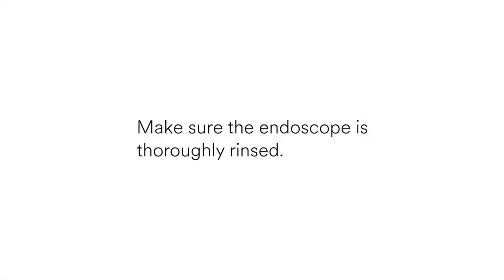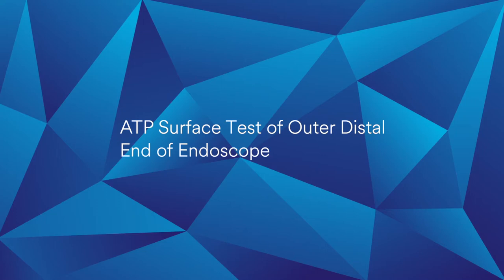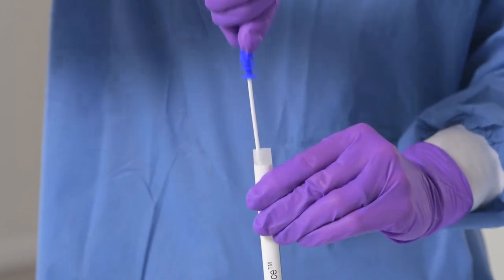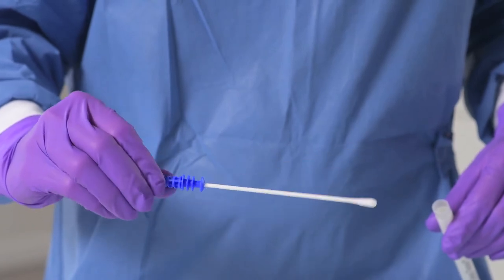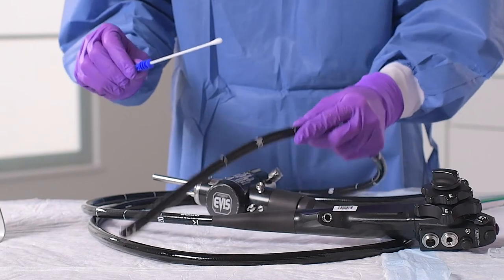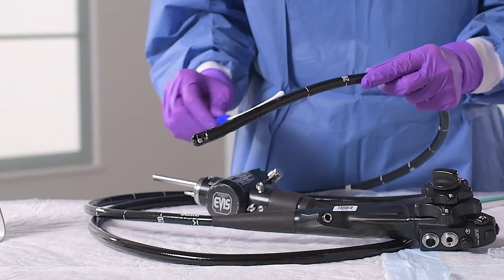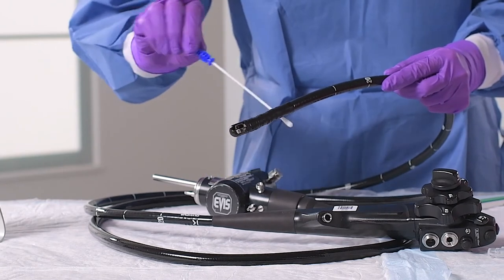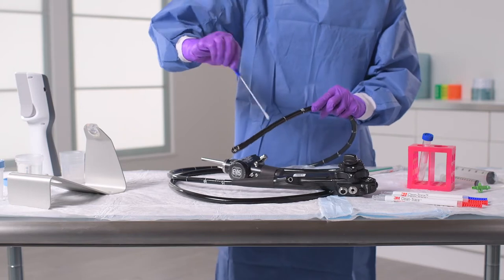Before you begin, make sure the endoscope is thoroughly rinsed. When you are ready to collect your sample, start with the surface test of the outer distal end of the endoscope. Remove the surface test UXC from the device sleeve, taking care to touch only the blue handle. Do not let the swab touch any surface except that which is to be sampled. Hold the test between thumb and forefinger so you can easily rotate the swab. Touch the swab to the outer distal end and apply enough downward pressure to cause the wand to flex. Move your swab back and forth to test all sides of the distal end for a length of about 10 cm or up to the first hash mark. During sample collection, rotate the swab to ensure sufficient contact between the swab and the surface being sampled.